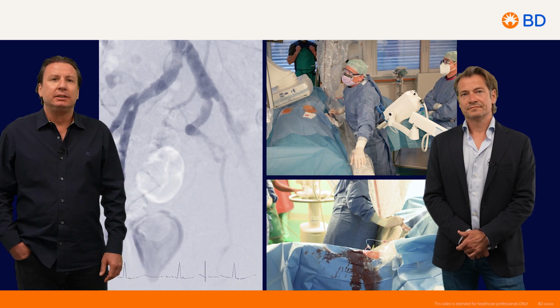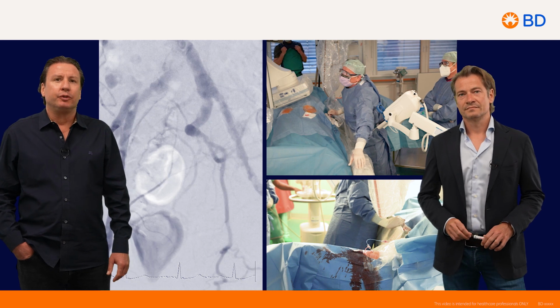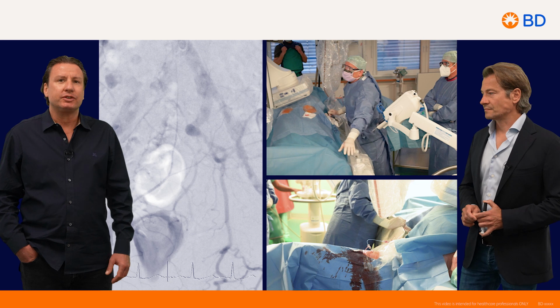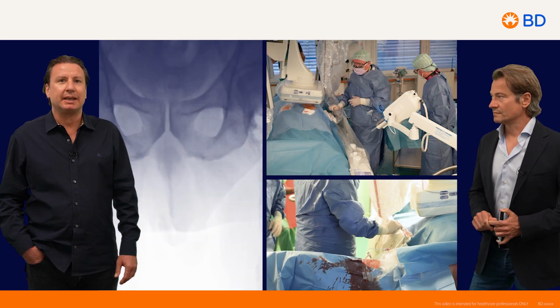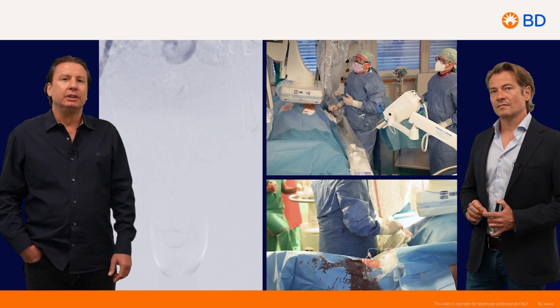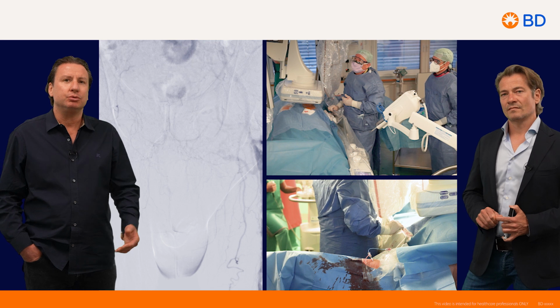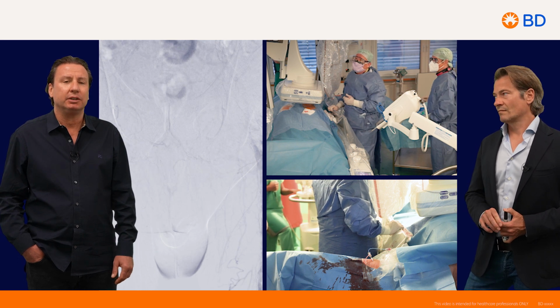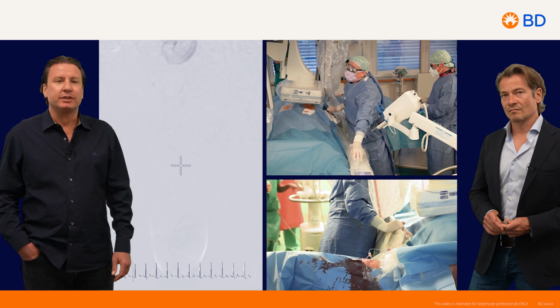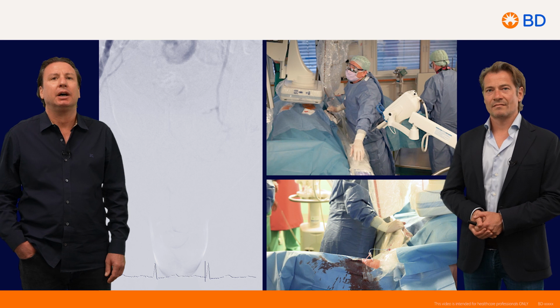So we decided in this patient to come from the arm, a transbrachial approach, for several reasons. First of all, as we always do our diagnostics with duplex scans, we had a very low monophasic flow on the left common femoral artery, and there was the suspicion of an iliac artery occlusion on the left side. As I said, the patient was very obese. It was impossible to have a direct view with the duplex into the iliac arteries.